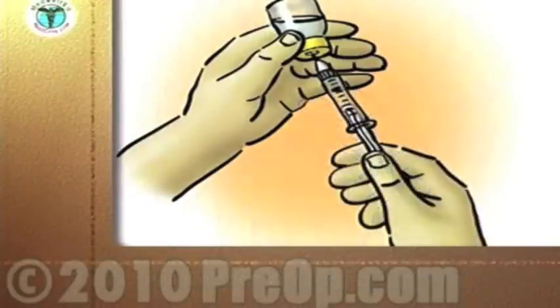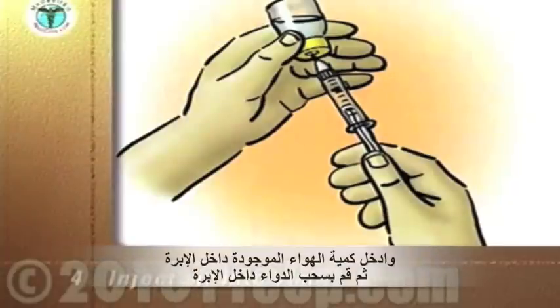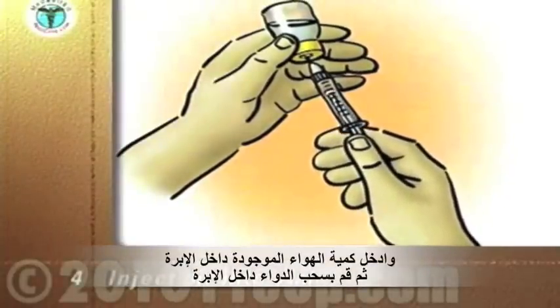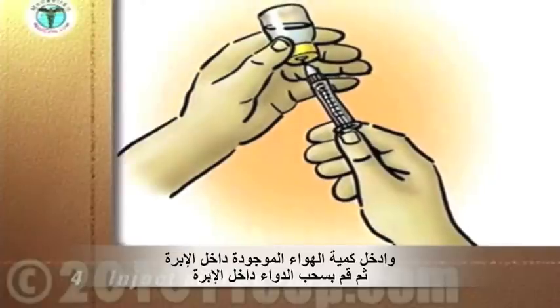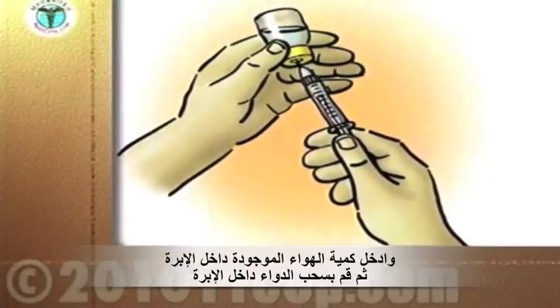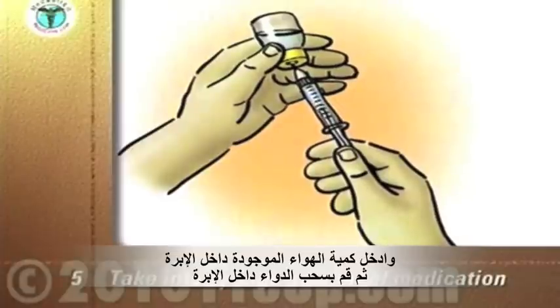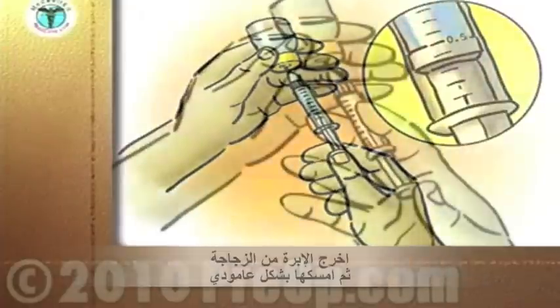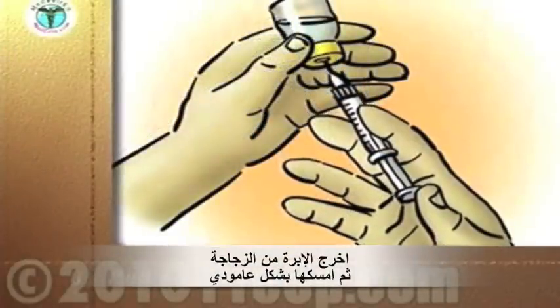Keep the tip of the needle below the level of the medication in the vial. Depress the plunger to inject the air into the vial. Slowly pull down on the plunger to take into the syringe the amount of medication prescribed for you. Pull the needle out of the vial.